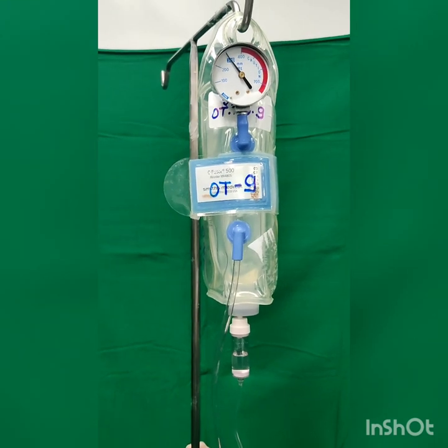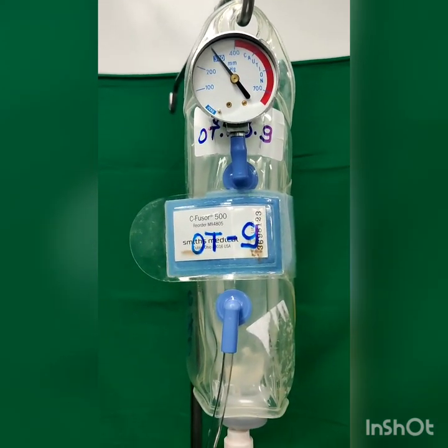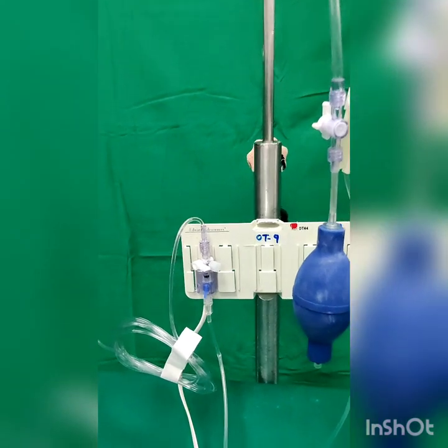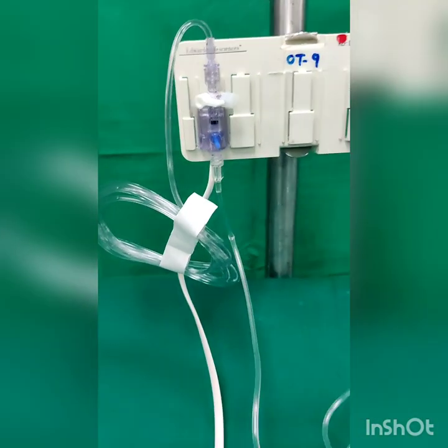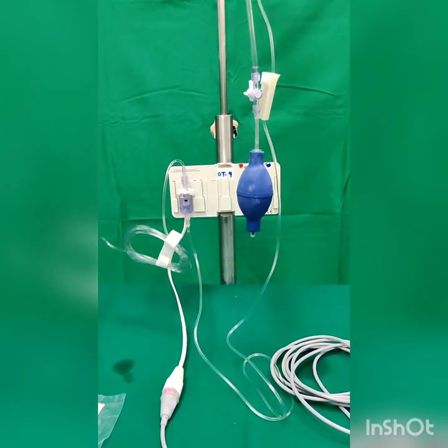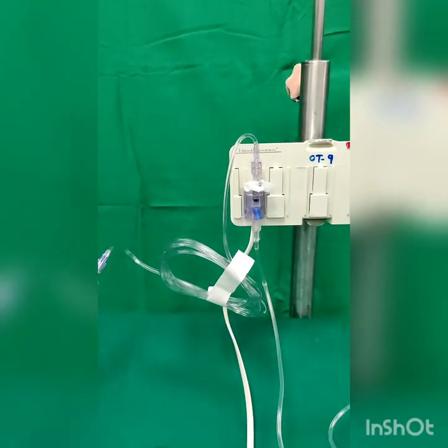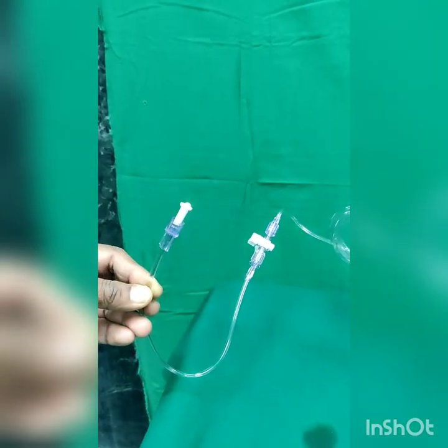The transducer setup has a 500cc normal saline bottle inside a pressure bag at a pressure of about 300 mmHg, to prevent backflow and to allow flushing the catheter when needed. The pressurized normal saline bottle is connected via flush tubing to the transducer. The transducer is placed in a holder; from the lower end it is connected to the transducer cable hooked to the monitor, and from the upper end it is connected with flush tubing to the arterial catheter.